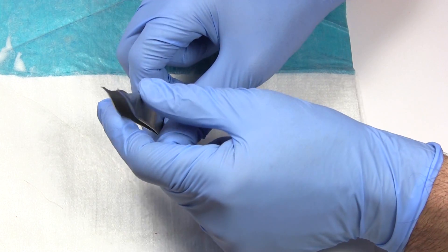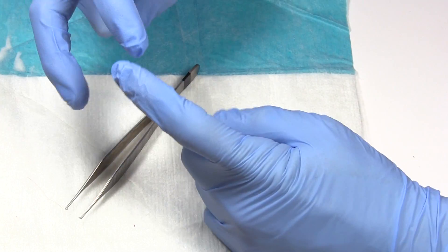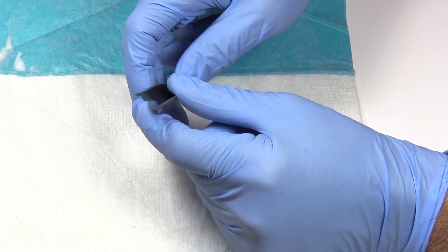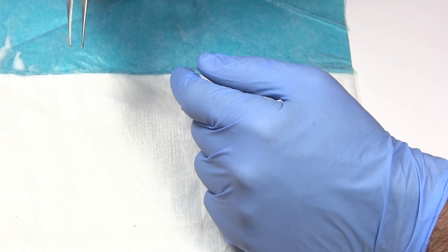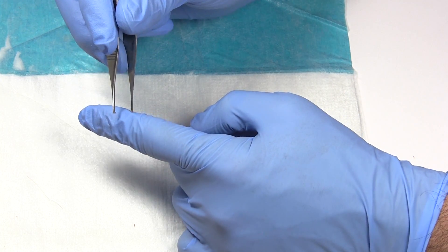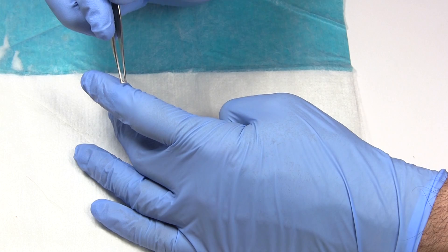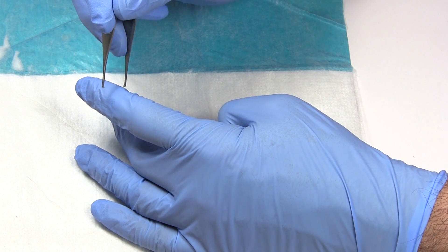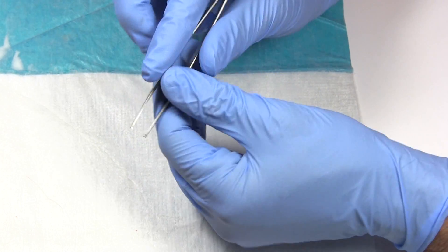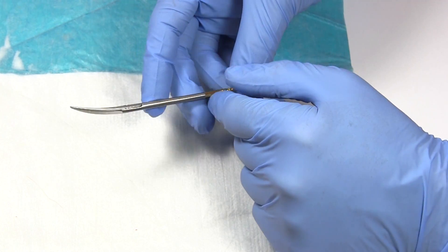You need some tissue forceps or pickups. These have teeth on the end — usually a two-tooth side and a one-tooth side that go into each other. One thing to note: you want to try not to crush the tissue. If my finger is the wound edge, you don't want to grab and crush the skin edge because that causes damage. Ideally, just pick it up with the bottom end — that's a lot kinder to the tissue.